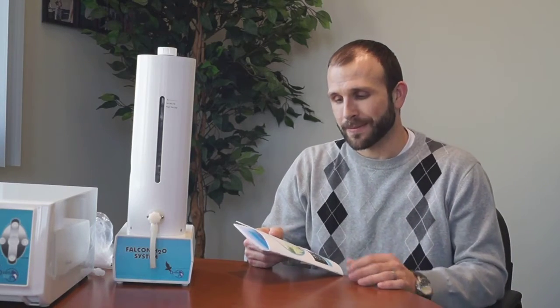Today we want to show you and talk about the different methods of administration for ozone and briefly sum them up so that you can easily begin to utilize ozone therapy in your clinic in a way that's going to improve outcomes. We have a simple treatment guide made for veterinarians, based on major ozone works from Europe. If you've purchased equipment from us, you'll receive this guide covering doses for animals depending on the method of administration. We're going to start with major auto-hemotherapy.